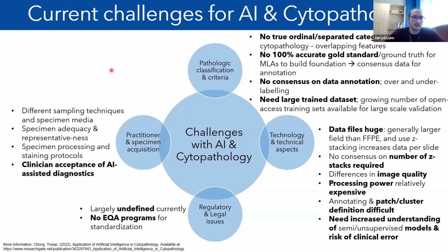There are, of course, challenges that are existing in the AI cytopathology interface as it stands. Different technologies use different samples. There are different sampling techniques. There's always the issue of specimen adequacy and inadequate specimens, clouding data sets, how specimens are processed and stained, as well as clinician acceptance of AI-assisted or AI-driven diagnostics.